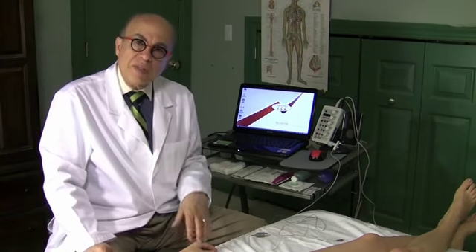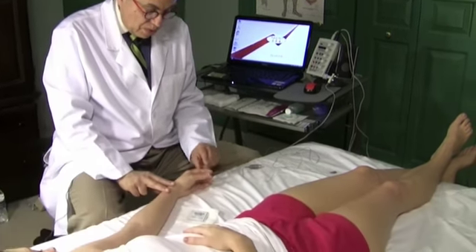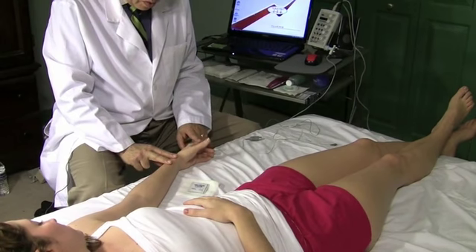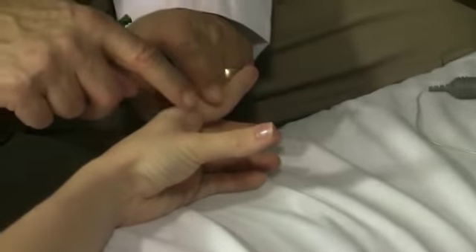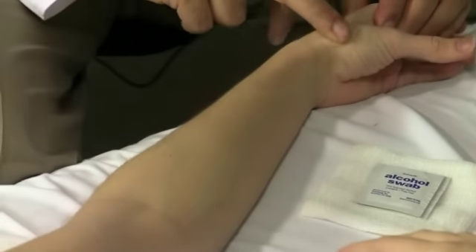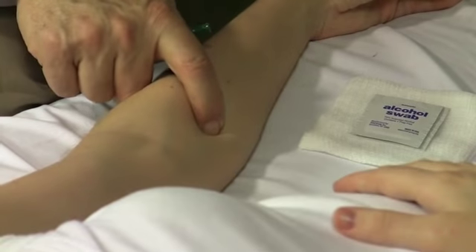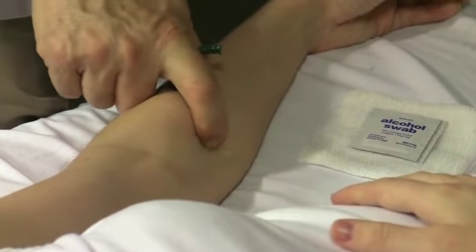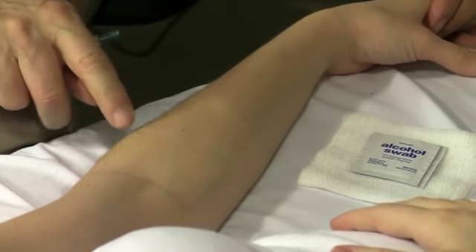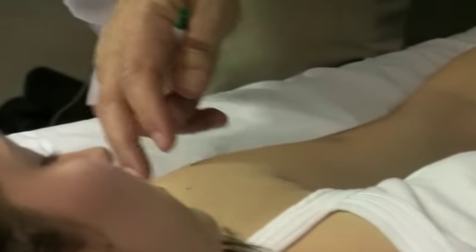The set of muscles that I study routinely in the arm is the first dorsal interosseous muscle. Bring your finger up like so. No, this one here. And this is the muscle between the index and the thumb. Okay, I study the flexor carpi ulnaris muscle. By the way, this is an ulnar innervated muscle, C8 T1 levels. I study the flexor carpi radialis muscle, which is a median innervated muscle, more likely C6 and 7. I study the brachioradialis muscle, the triceps, and the deltoid. Then I do the paraspinals in the neck.